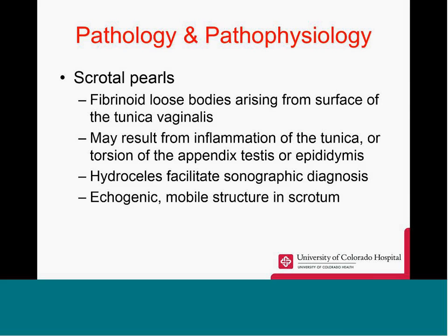Scrotal pearls are a fibrinoid loose body arising from the surface of the tunica. This may result from an inflammation of the tunica or torsion of the appendix testis or epididymis. A hydrocele does facilitate the sonographic diagnosis. You're going to see an echogenic mobile structure within the scrotum.